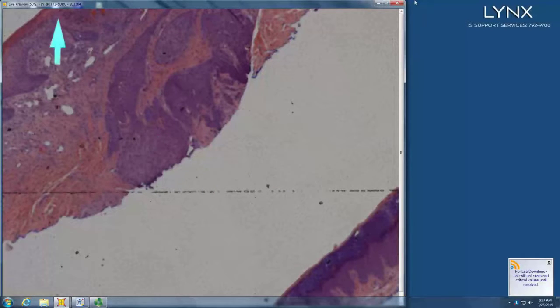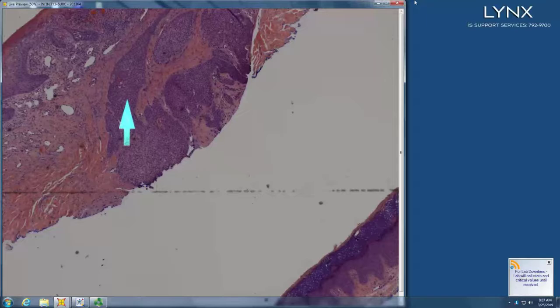Kind of. So that's a little CNH-ish, right? But it's over a little tumor. Poroid thing, exactly. So it doesn't palisade, it has cytoplasm, and it has little white circles that are attempts at duct formation. Right. So no palisade, ample cytoplasm.